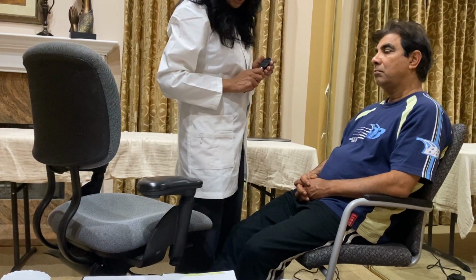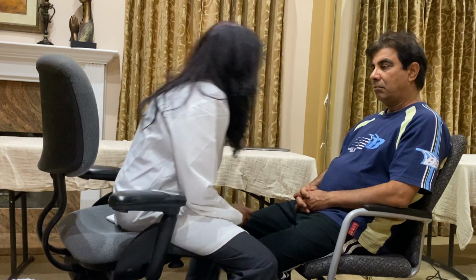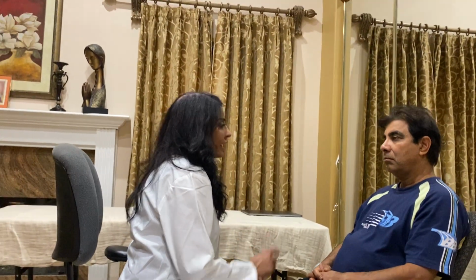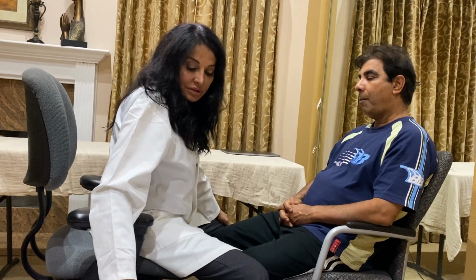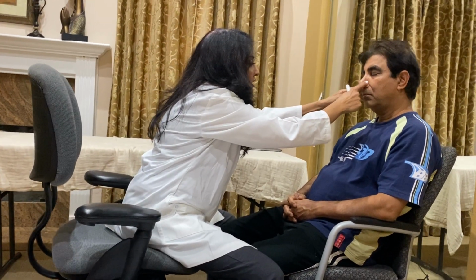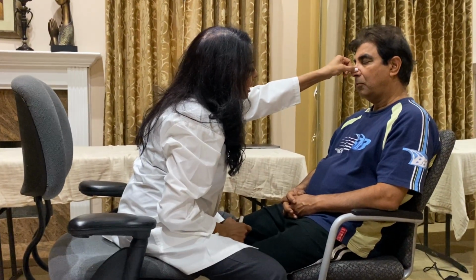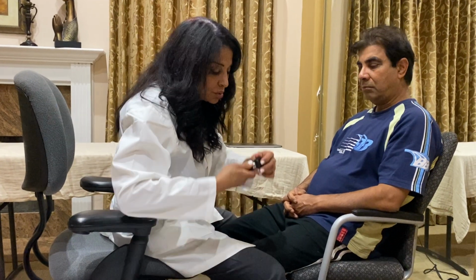And I'm going to now do the nose exam for you. On inspection, I see that your nose is straight and midline. The ala is equal. The septum seems to be equal. I'm going to flash some light. I'm going to palpate your nose first, and I don't see any lumps and bumps. There seems to be no trauma, no pain, right? I'm going to check into your nose, and I'm going to use my otoscope for that.